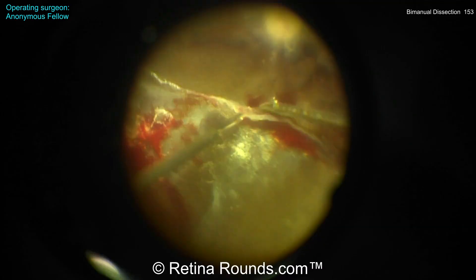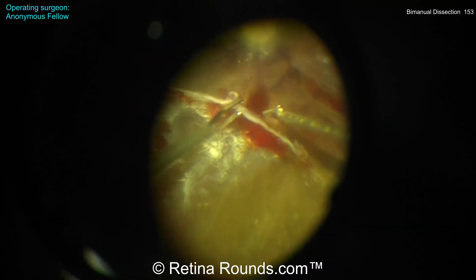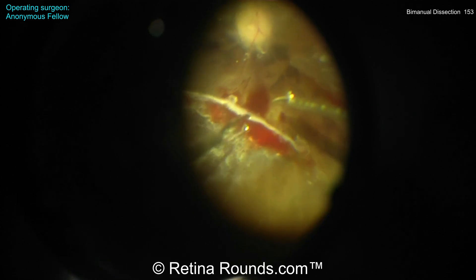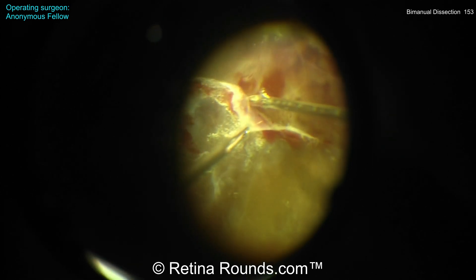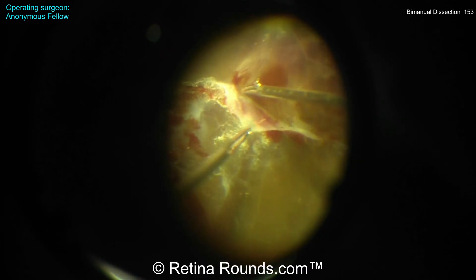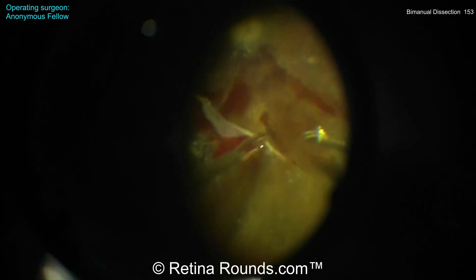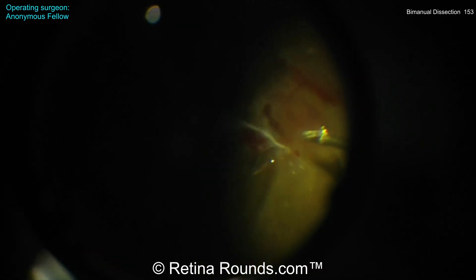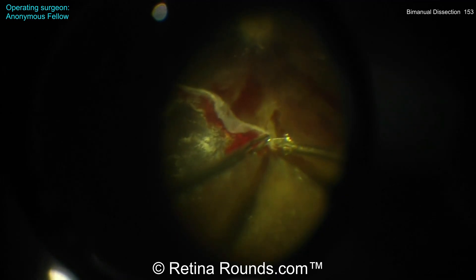You can see this posterior membrane being pulled, and again the angle here is really tough. What I would much rather see is a more temporal-to-nasal or nasal-to-temporal approach. In this case, by going posterior-to-anterior, the scissors are very vertically oriented, and that vertical orientation is going to be a setup for potentially creating an iatrogenic retinal break.